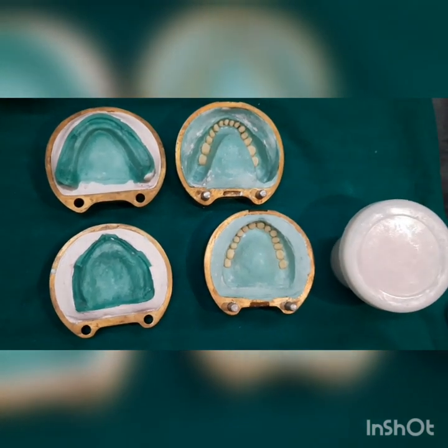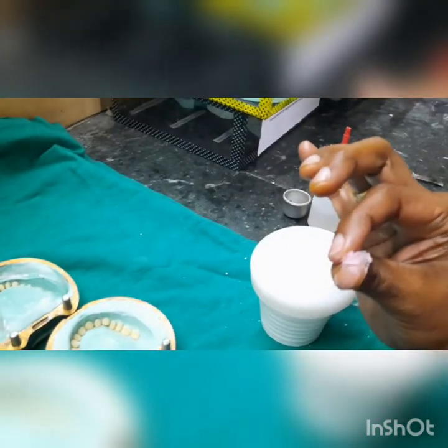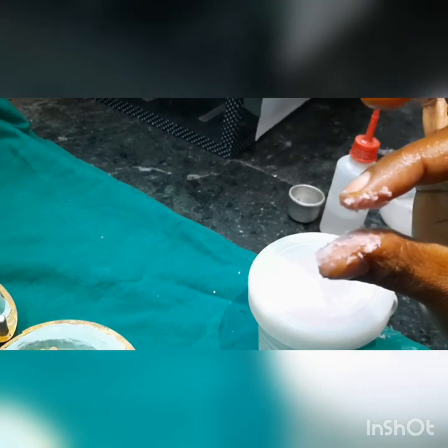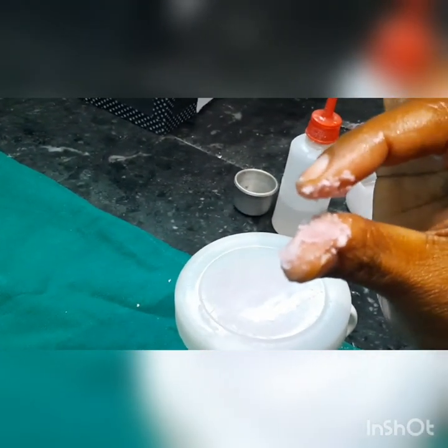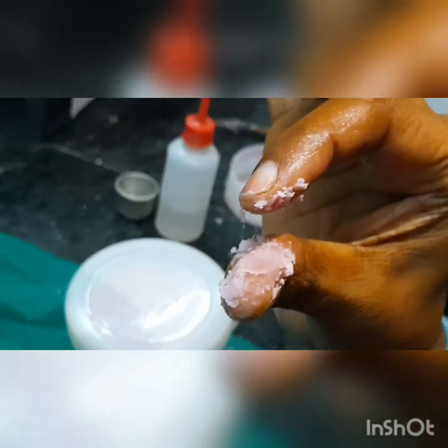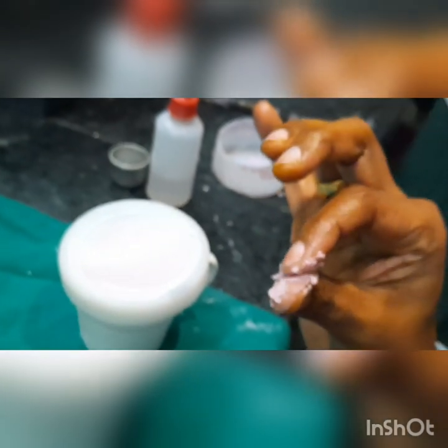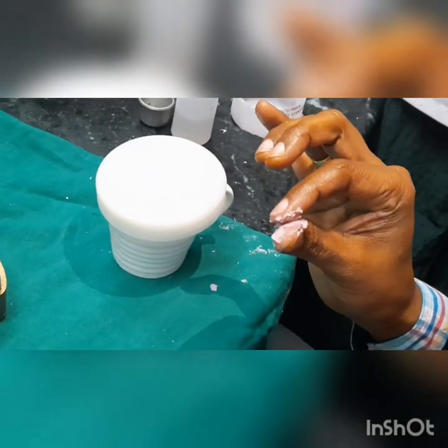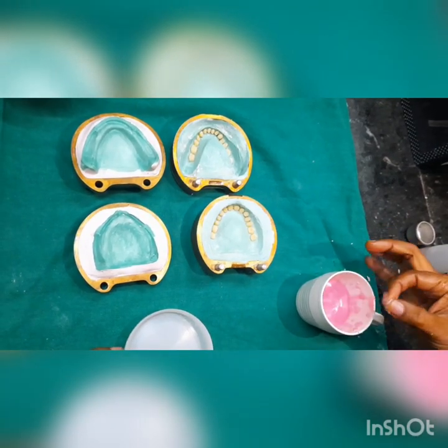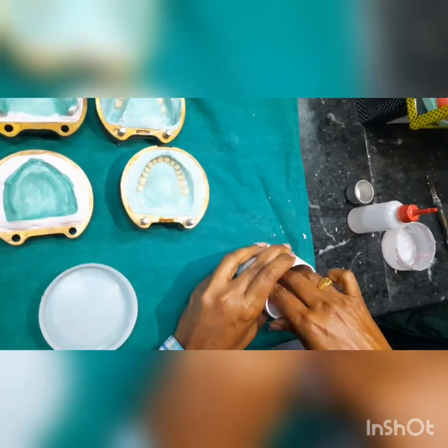After the dough stage, you have the sticky stage and finally the stiff stage. Check whether the dough stage has been achieved — make sure it is not in a stringy or sticky stage. You can see some strands coming out, so we need to wait a little more. Once the mix is not showing stringiness, it is in the dough stage and that is when we do packing.